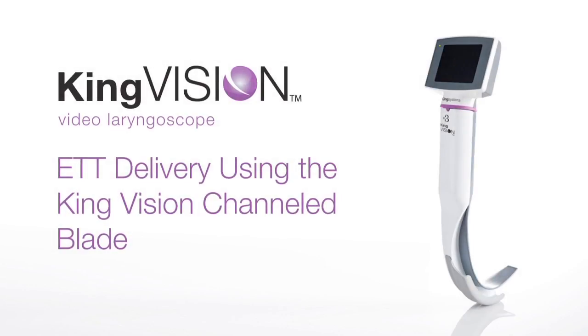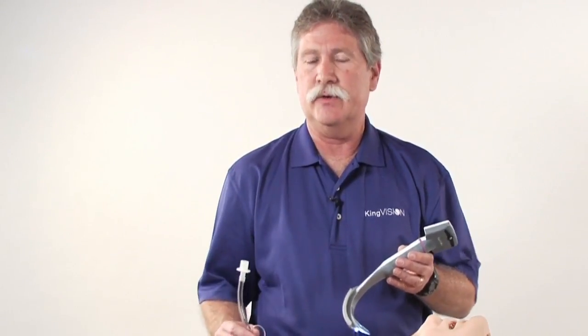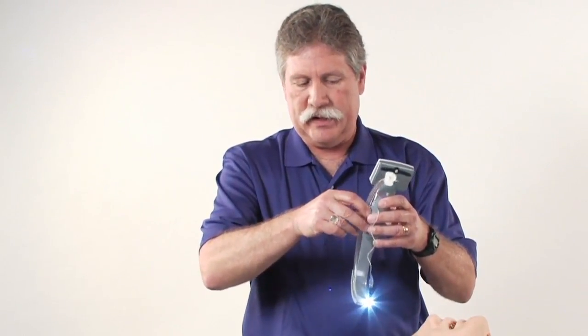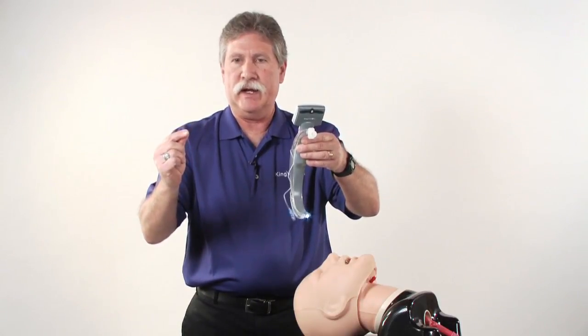Some key aspects associated with the channel blade for the King Vision Video Laryngoscope: this has an 18 millimeter mouth opening requirement. Because of the channel, no stylet is required. The channel does allow standard tracheal tubes from 6 to 8 millimeter. It's important to note that you are manipulating where the tube goes with the blade itself, as opposed to freehand with your right hand.